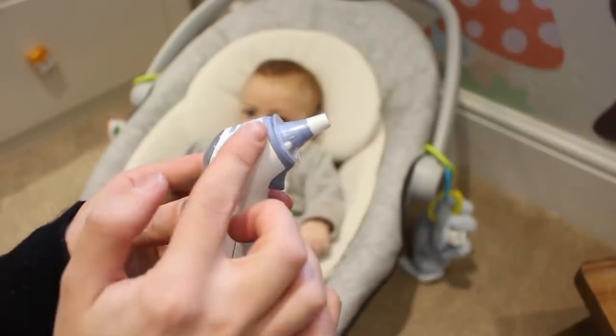The thermometer that we have is the Braun Thermoscan 7, and so many of you guys have recommended this to us because you can use it from birth right through to adulthood, thanks to the wide-angle probe that is suitable for newborn babies.